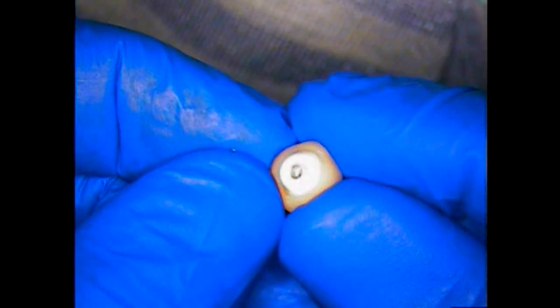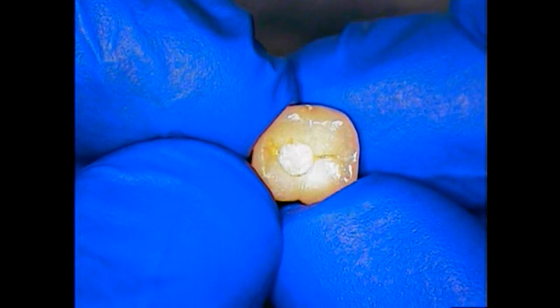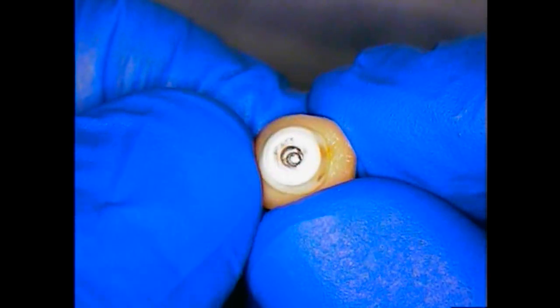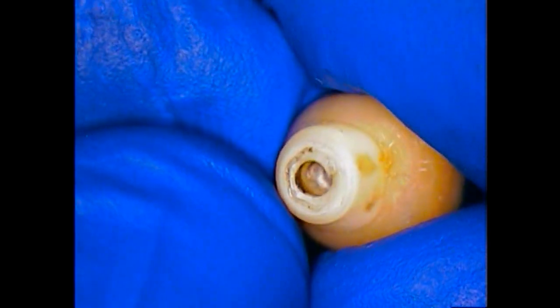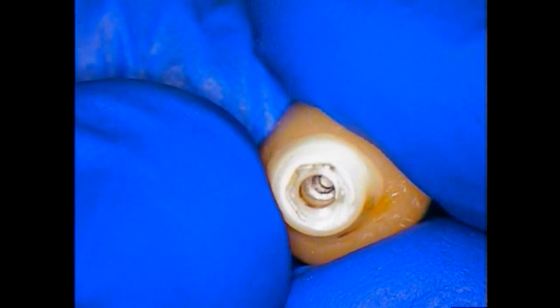I'm here with a 3i ceramic abutment that has fractured, and also the head of the screw is fractured off as well. This is the molar in a number 31 position. This is what we're looking at as far as what the patient had in her hand. You can see there is a ceramic abutment component — it's screw retained. It failed right at the interface between the implant fixture and the ceramic abutment. Our mission today is to go in and get not only the screw out, but also the remnants of the fractured ceramic abutment component.